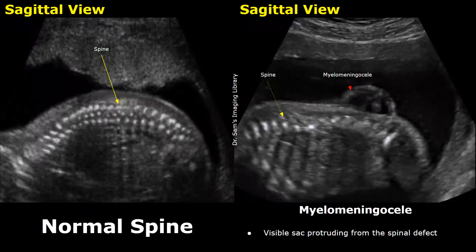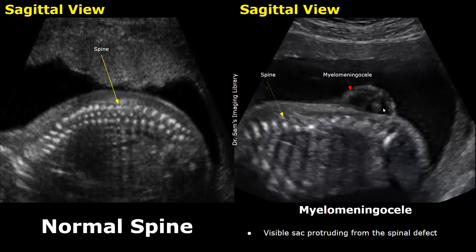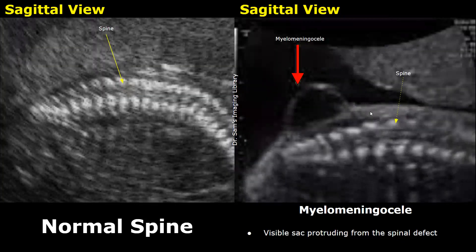Spinal defects are also seen. The image on the left is a sagittal view of a normal fetal spine. The image on the right shows a myelomeningocele — there is a defect in the spine which leads to protrusion or herniation of spinal contents through this defect, forming a myelomeningocele. The herniated contents are in a sac. This visible sac protruding from the spinal defect is a myelomeningocele, associated with Edwards syndrome. It commonly affects the lumbar region, although any region of the spine can be affected.